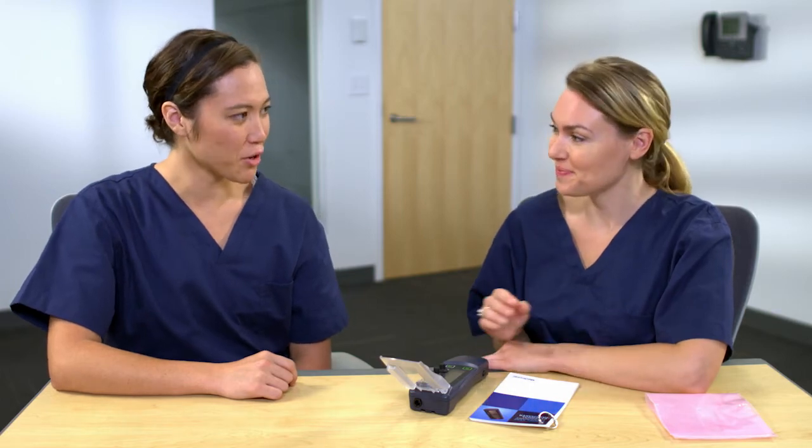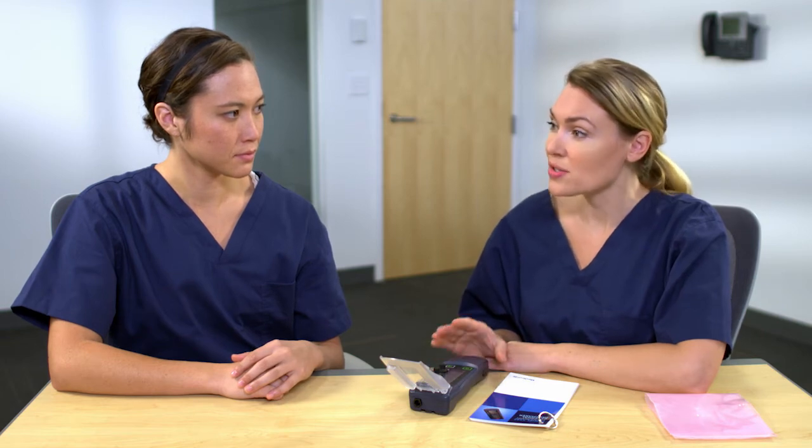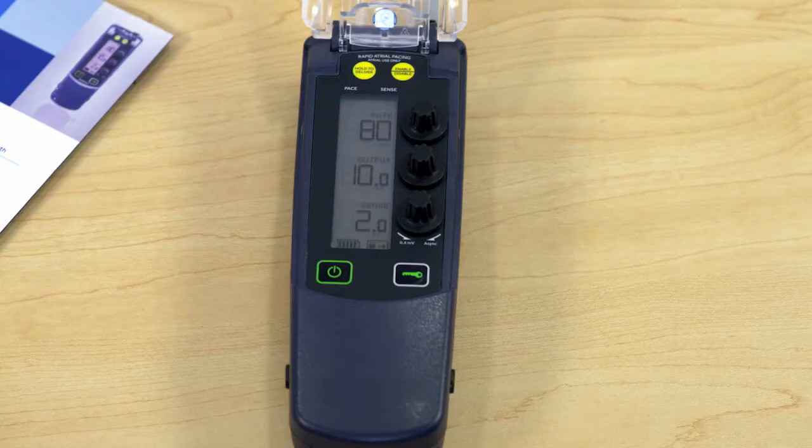Let's turn the device on so you can see how it provides safe single chamber pacing support with just these three control knobs. To turn it on, simply press the power button. Remember, when connecting to a patient, be sure to have parameters set that will not cause pacing until sensing has been established. You'll also want to turn the outputs to 0.1 milliamp so there's no pacing until sensing is established. It's ready to pace at 80 paces per minute and 10 milliamps for either the atrium or the ventricle.